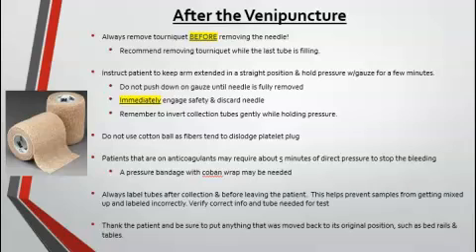The last thing you want to do before you leave the patient's room is to thank the patient for allowing you to complete the blood draw, and to put everything back in order in the patient's room. If you moved anything to complete the blood draw, make sure you put it back in its original position.